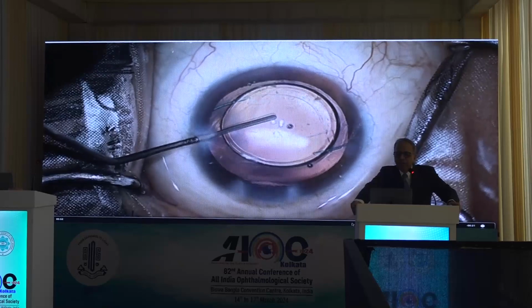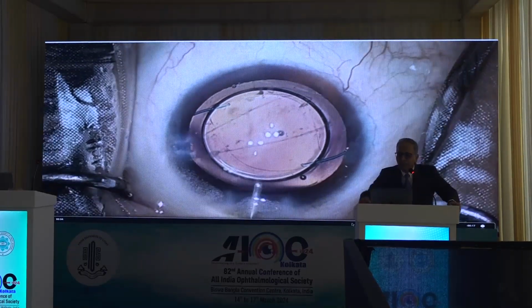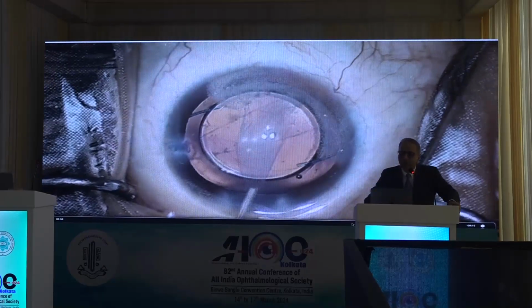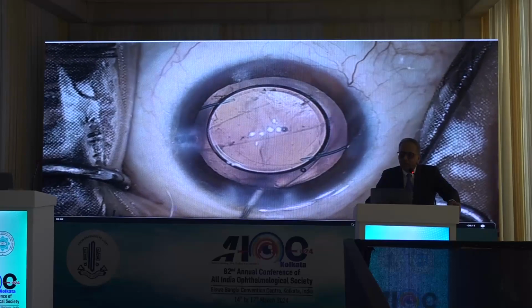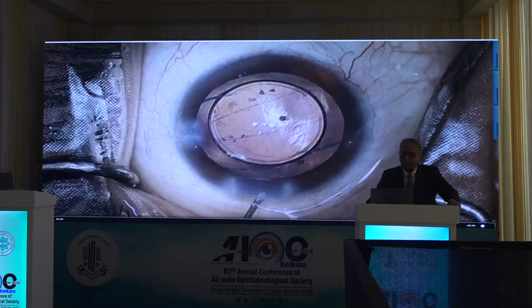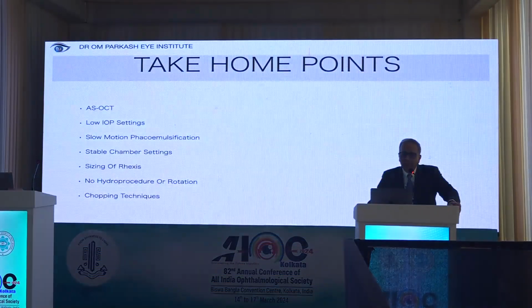an oval rexis, and you will find that it is complete, spindle shaped as Dr. Saurav has shown. Triamcinolone again, and you can find now that the case has been adequately completed. This is the post-op day 1, and the patient was very happy.